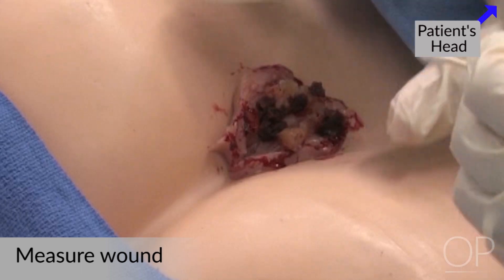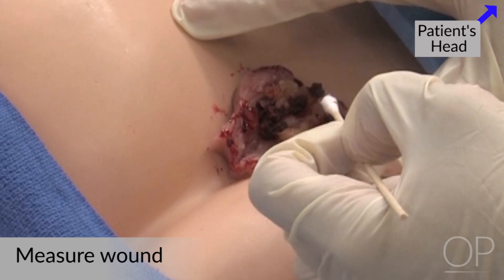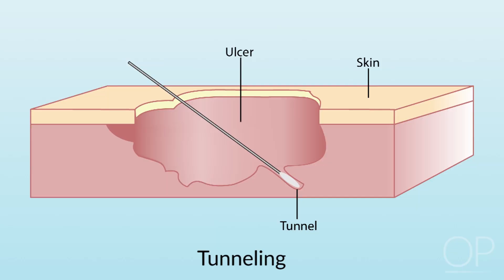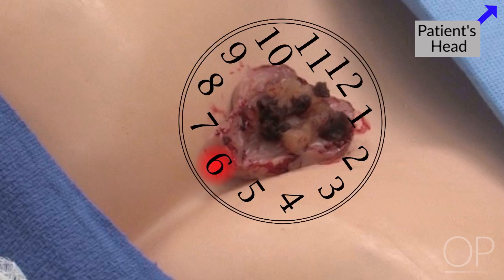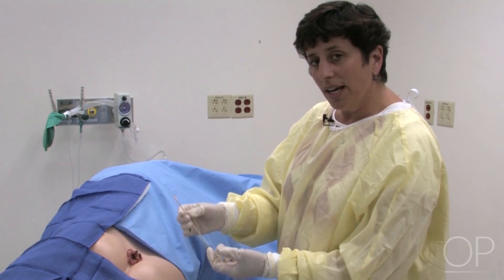There are areas that will potentially become deeper in this wound as this slough and eschar starts to come off. Also, if this wound has some open areas, you want to feel all the way around the wound to see whether there's any areas of tunneling, where the wound goes underneath the skin, or undermining, where there may be spaces underneath the edge of the wound. When you document those, you should document them as on a clock. So if I found an area down here, I would document that there was a tunnel or undermining at six o'clock, so the next person who comes to care for this wound has a good idea of what they're going to find.